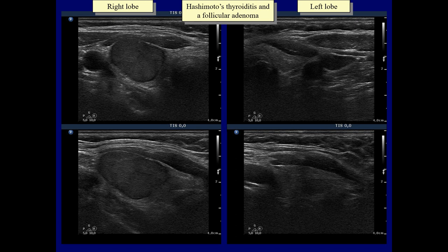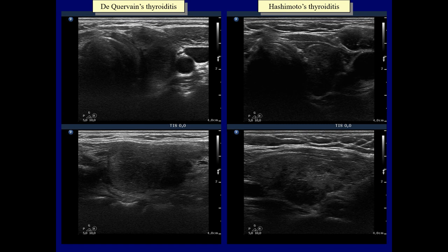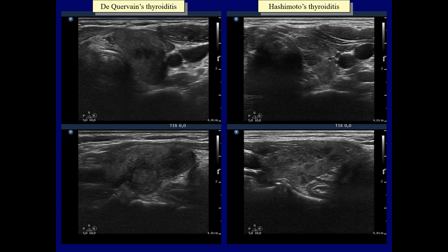The basic echostructure of the thyroid is minimally hypoechoic and there are small hypoechoic areas in both lobes. Multiple hypoechoic areas are found in both cases. The lesions in de Quervain's thyroiditis display blurred borders while those in Hashimoto's thyroiditis display sharp borders. This table demonstrates the main difference between the two forms of thyroiditis: the hypoechoic fields in de Quervain's thyroiditis present ill-defined borders while those in Hashimoto's thyroiditis display sharp borders.